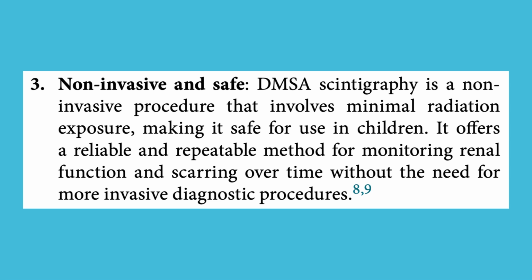3. Non-invasive and safe. DMSA scintigraphy is a non-invasive procedure that involves minimal radiation exposure, making it safe for use in children. It offers a reliable and repeatable method for monitoring renal function and scarring over time without the need for more invasive diagnostic procedures.